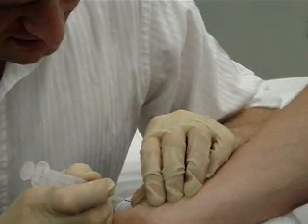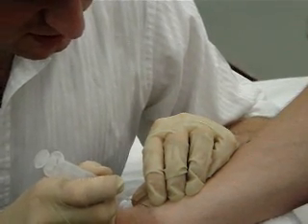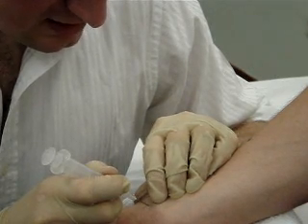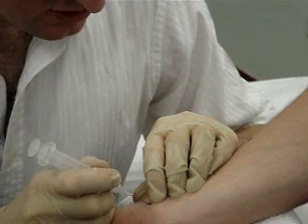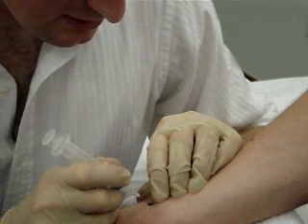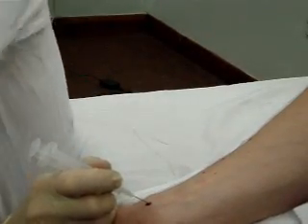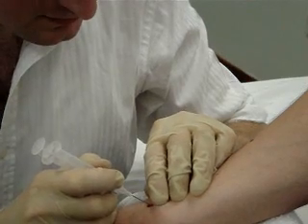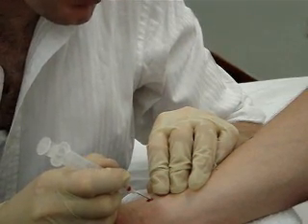Palpating just with the tips of my fingers to relocate the artery — it's just there. I'm just going to feel a sharp scratch in just a second. What I've done here is I've gone just to the left of the radial artery, so I'm just going to withdraw the syringe and aim at a slightly different angle towards the artery — that's the normal thing to do in this situation. If at first you don't succeed, just withdraw the syringe. Now I'm just going to relocate the artery, and as you can see the syringe is now self-filling because it's inside the radial artery, and the syringe will just fill up slowly.